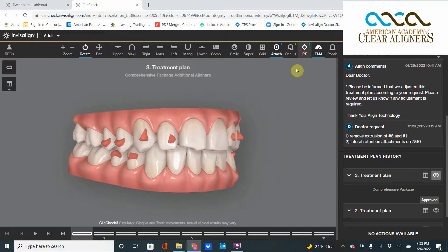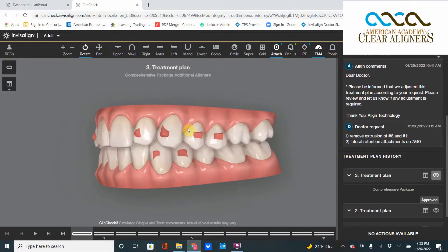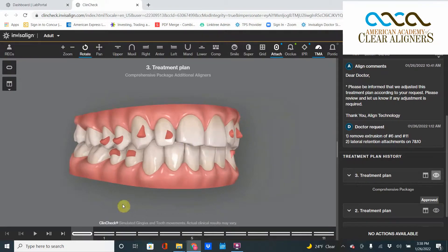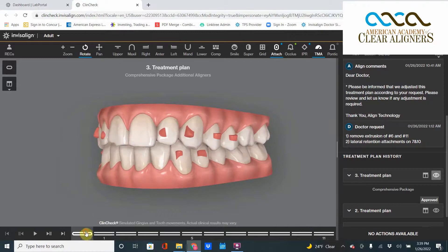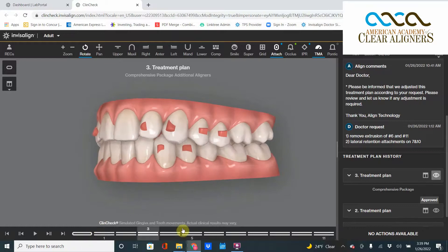I want you to visualize this right now. The canine here is in a perfectly canine-guided occlusion — that canine is in perfect position. But sometimes the program or technicians like to do a little bit of extrusion of that canine. See how that canine is sliding down the lower canine angulation? That is not a good movement. That is a canine moving below the occlusal plane, which is going to cause an interference and pretty much destroy the very nice canine-guided occlusion that is happening there.